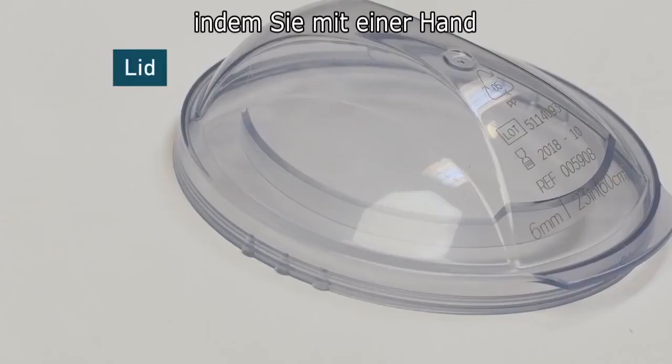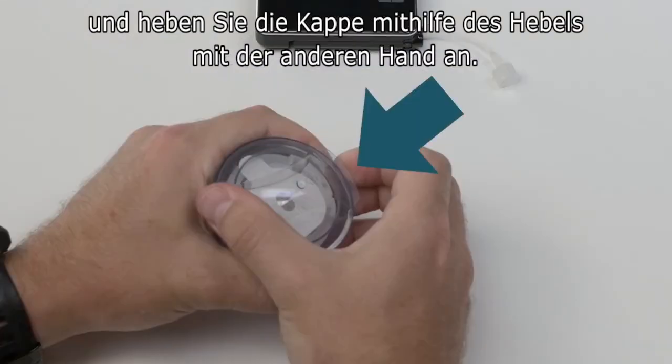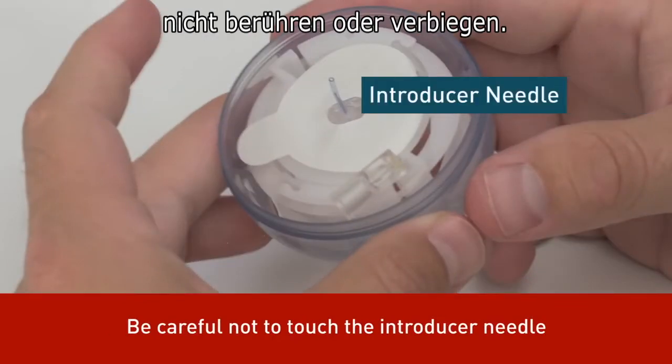Now, remove the lid by pressing the three raised dots on either side firmly with one hand and lifting the flat tab of the lid with the other. Be careful not to bend or touch the AutoSoft 90 introducer needle when preparing the inserter and infusion set.